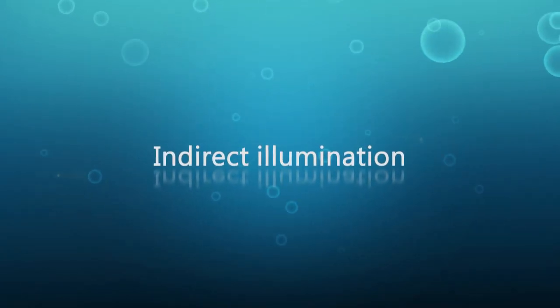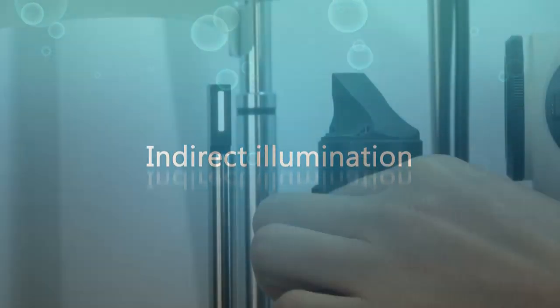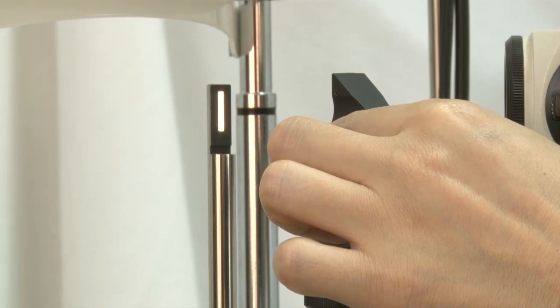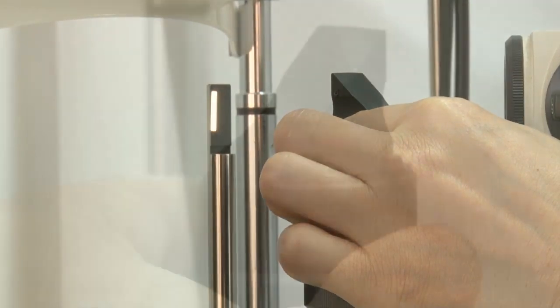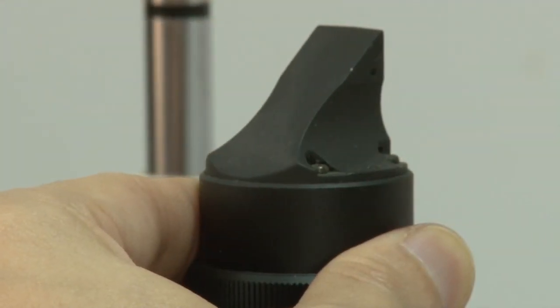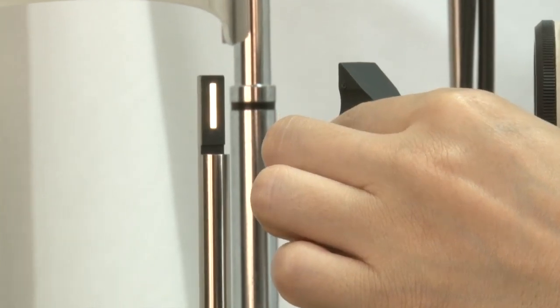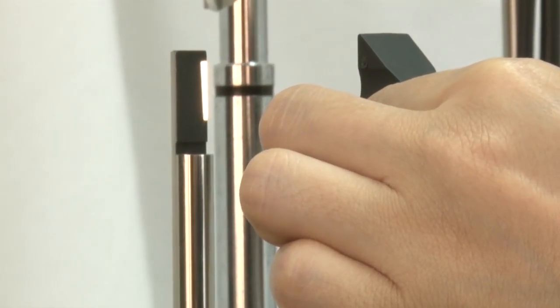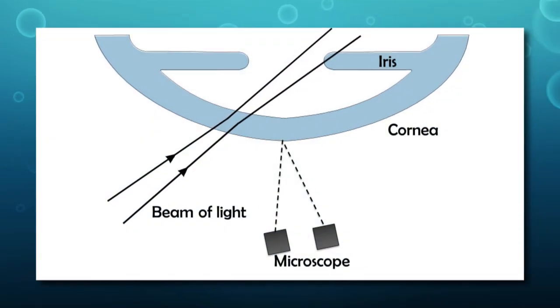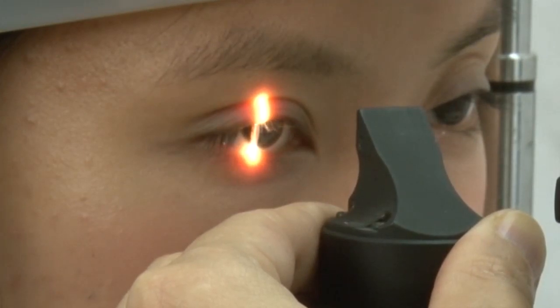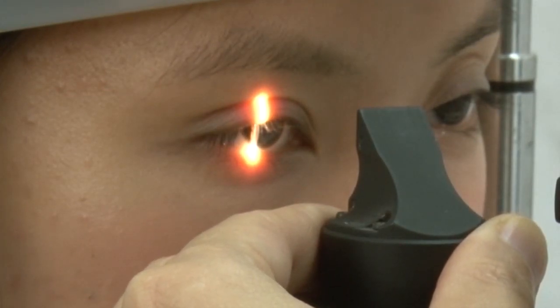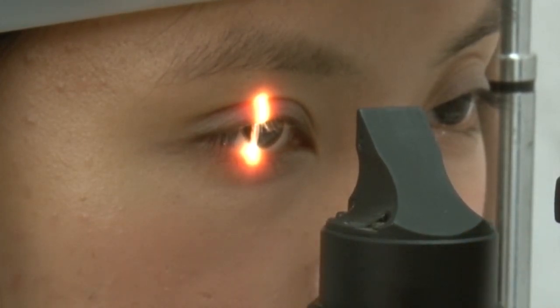The third type is indirect illumination. The light source and observation focus do not coincide on the same spot. This can be done by rotating the mirror of the light source out of the click position. It is useful for viewing semi-transparent structures against an illuminated background, or the surface characteristics in areas adjacent to the light beam, where these details are otherwise washed out by the intensity of the light beam itself.